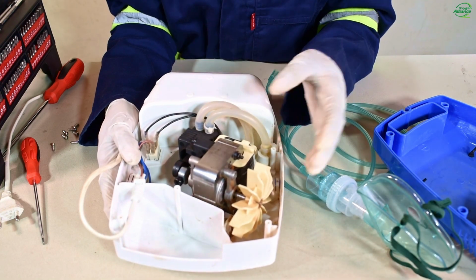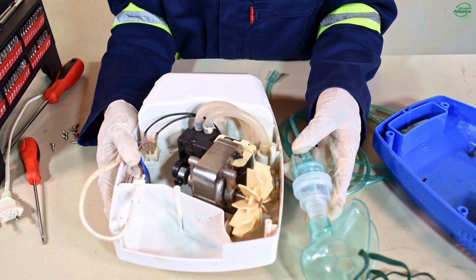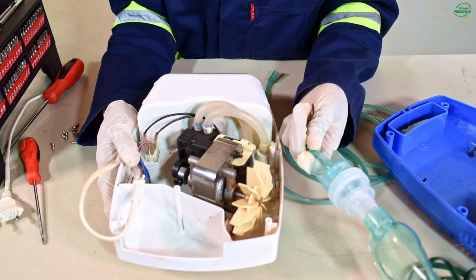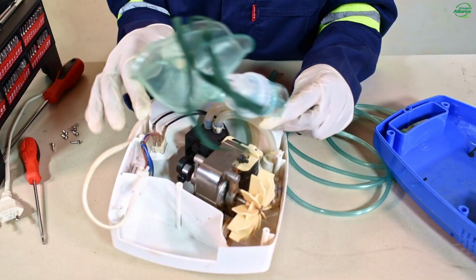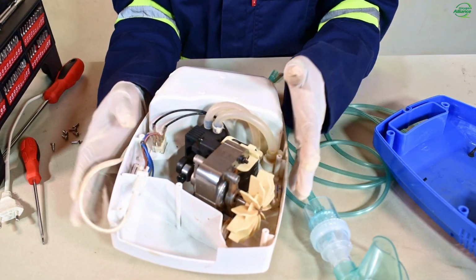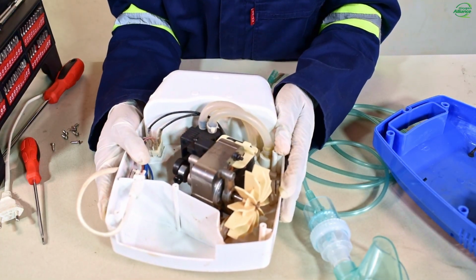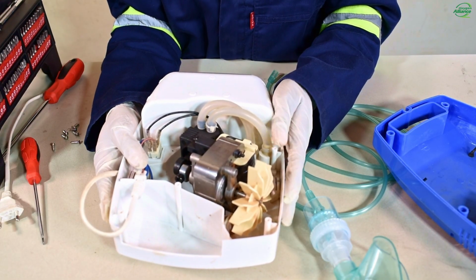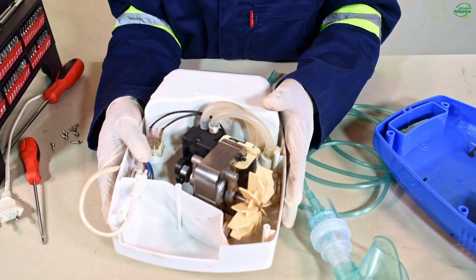Another cause of these leakages includes cracked tubings, and these cracks may occur anywhere along the tubings. Make sure that you carefully inspect all connections, and a simple method of doing this is applying foam to the suspected areas while the system is running.